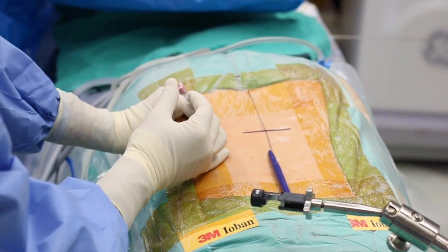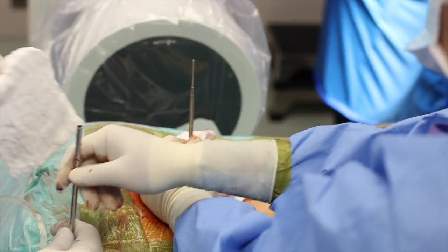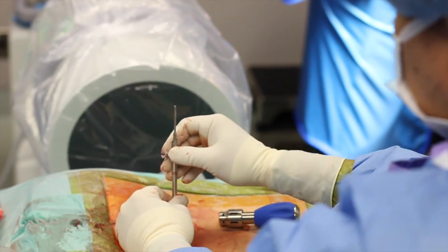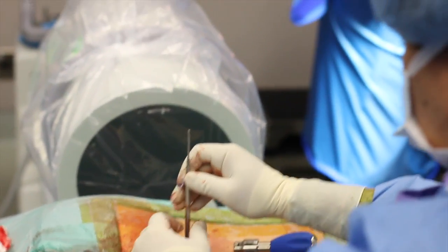We start out with a needle, and over that needle we make the incision slightly bigger and bigger and bigger. We dilate open the surgical corridor instead of making an incision and spreading it open — we dilate it open. In the end, the amount of dilation is much smaller than when we do a microdiscectomy.